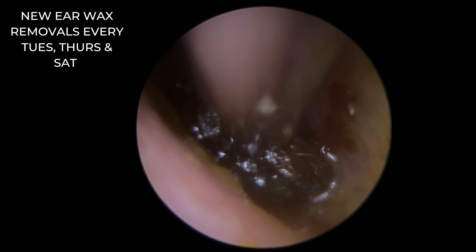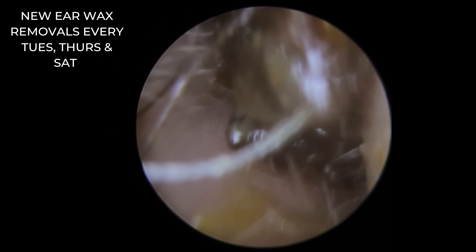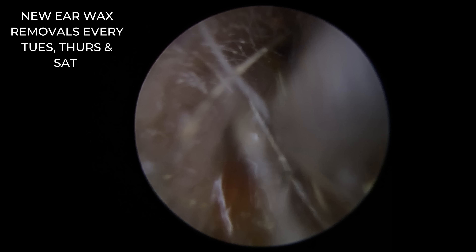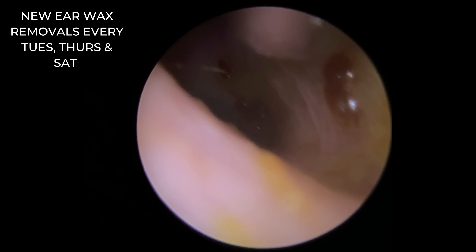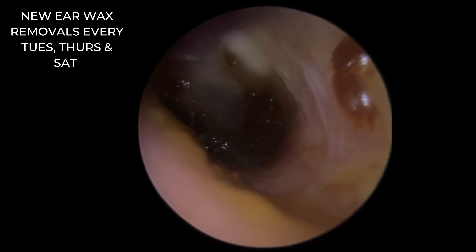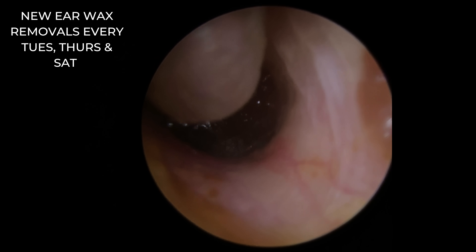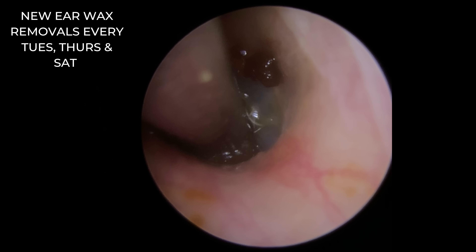Just see the top of the eardrum there. Let's take this bottom section away. There may be a little piece further in as well. Let's get rid of all these pieces — they are very crumbly, dry pieces, so lots of little bits all stuck together on this one. Now we're looking right down on top of the eardrum. Let's get the lay of the land — you can see how the wax has gone right down on top of the drum, really impacted down in there. So let's very gently hover over this wax and try to draw it to the suction.